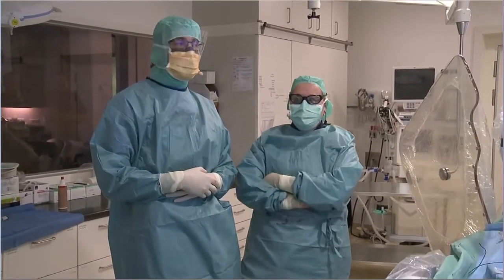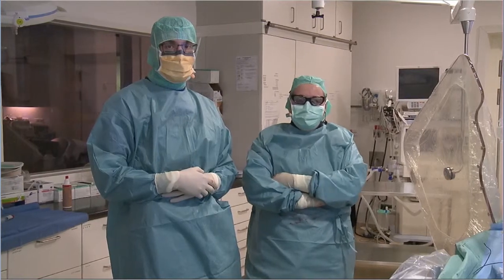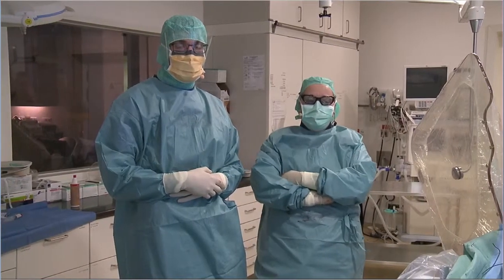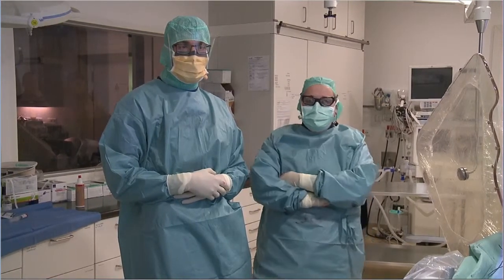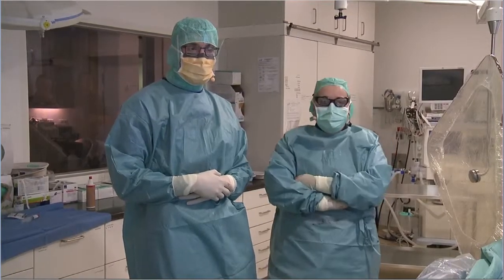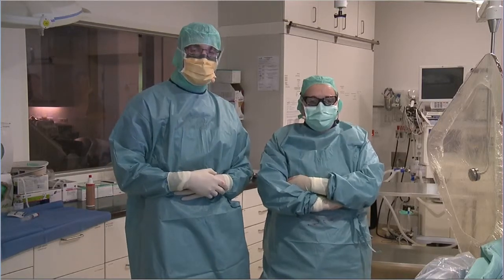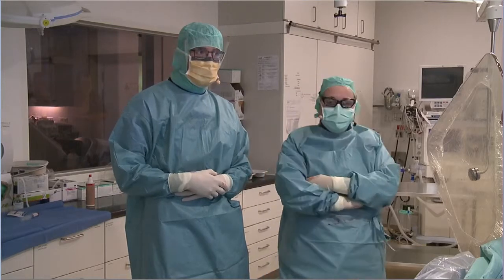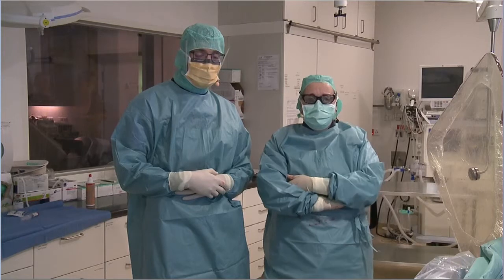First of all, I welcome you today in the name of the Department of Diagnostic and Interventional Radiology at University Hospital in Frankfurt to our live case transmission. I would like to introduce my colleague, Dr. Boris Bodel, and I'm Tatiana Gruber. And our case today is transarterial chemoembolization of HCC.